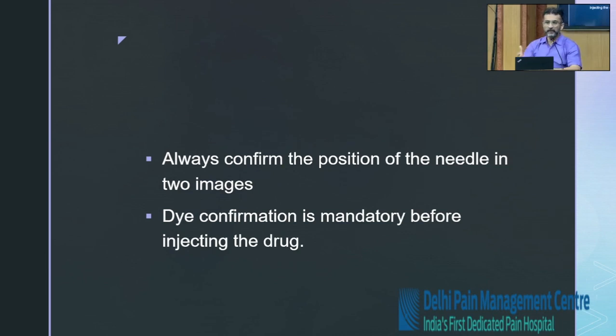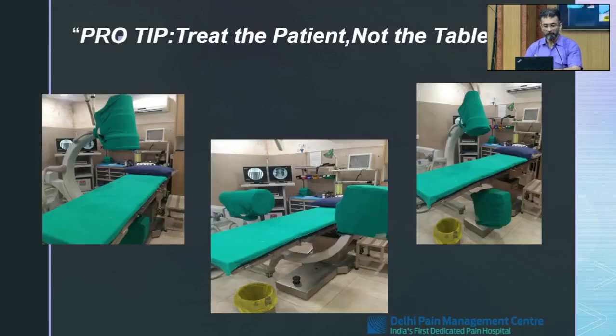Third, now these are the golden words of my teacher, Dr. Dhruv sir. He said, putting in a needle is not the final thing, getting a good dye spread is the key. Wherever there is the dye, there is going to be drug. So getting beautiful needle positions is not the point. Getting a good, perfect dye position is what we are looking for. With that background, let us start with the images.